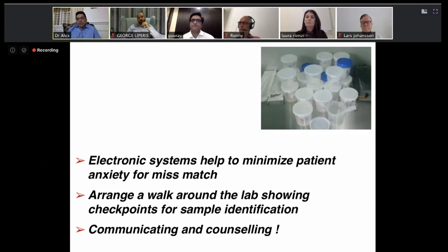Yes. When we talk about, because the question was if a morbidly afraid patient, it is not only that. I think there was some study done that was published in a journal 5 years back. That was a survey-based study that shows that 90% of the couples that undertook that survey, 90% of patients are afraid of the mix-up, and that says that maybe electronic witnessing helps around 95% of that group. But again, when you have such a particular type of patient, it is more psychological, as Laura has mentioned.